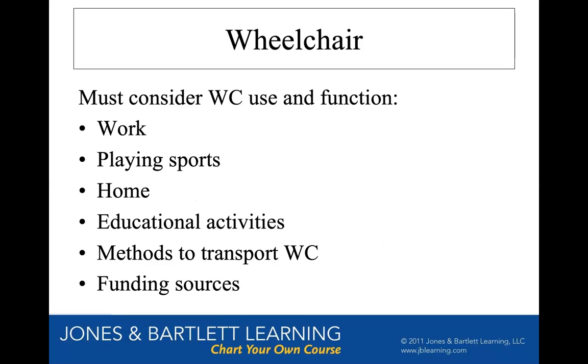Do they need a chair to transport the wheelchair from point A to point B to make it easier for an elderly couple to get each other into their doctor's appointments? Or do they need a certain chair to function, but their funding is not going to pay for all of it, so we have to compromise on some of the bells and whistles? So some things we have to consider.